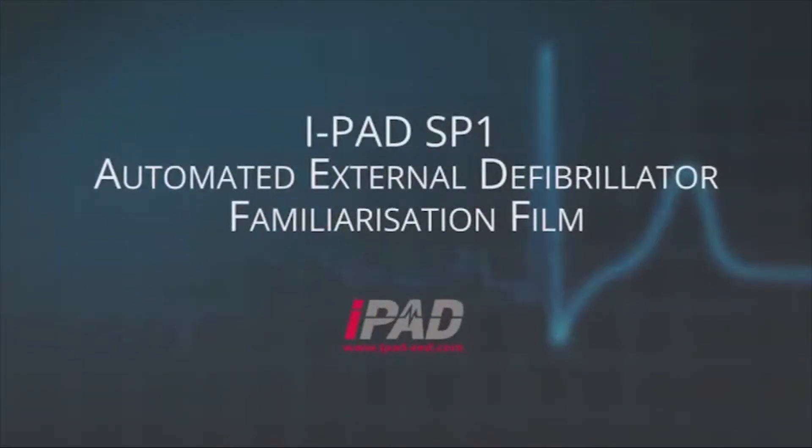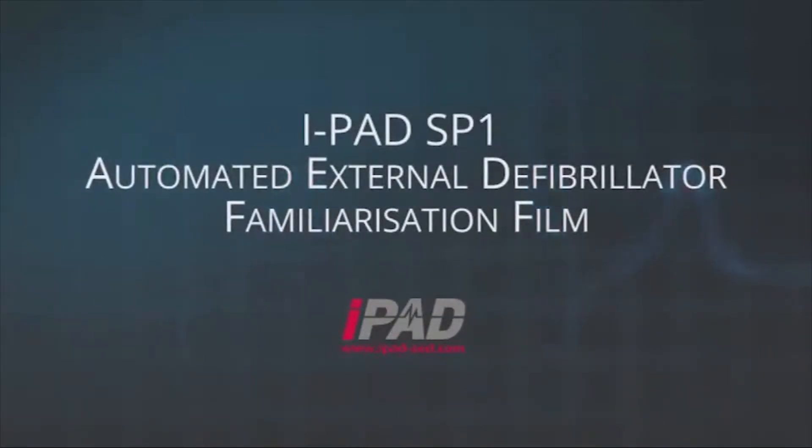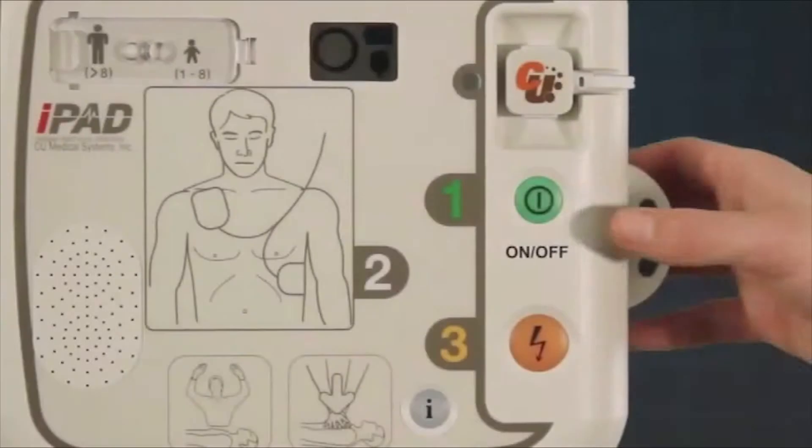Welcome to the familiarization of your iPad SP1 automated external defibrillator. This section will familiarize you with how the iPad SP1 works when used.